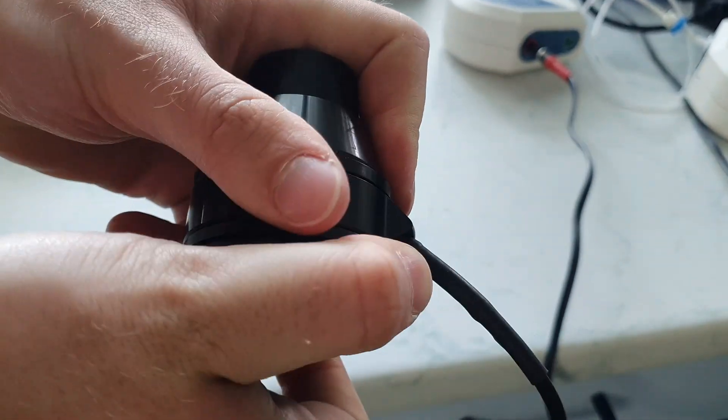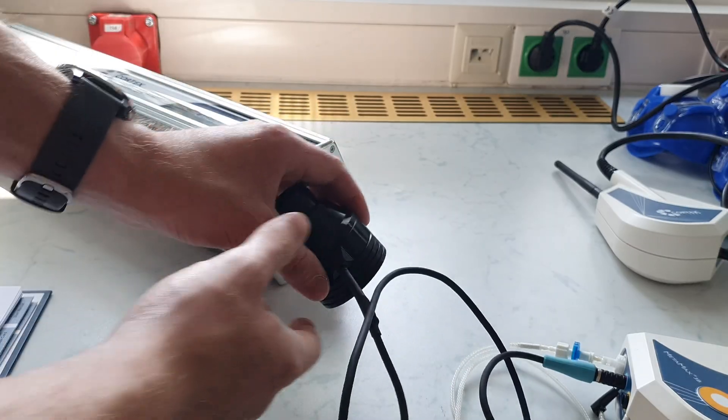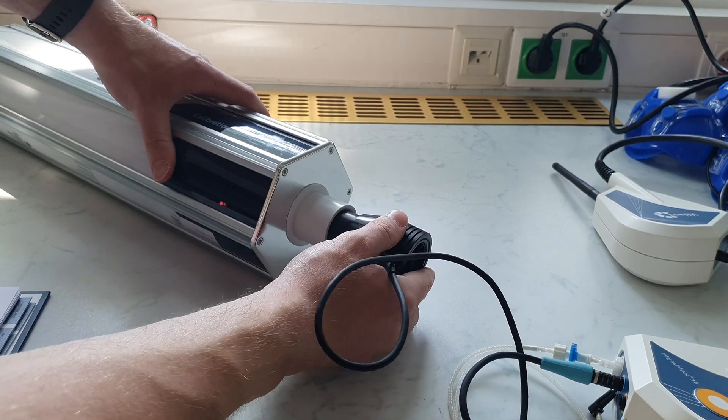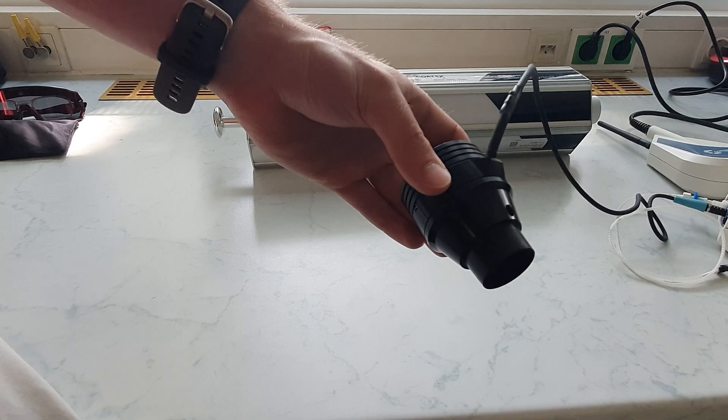The volume sensor is connected to the mobile Spiro in the same way as the power cable. Now the volume sensor is connected to the calibration pump. It is important that the small black plug is inserted in the turbine adapter.